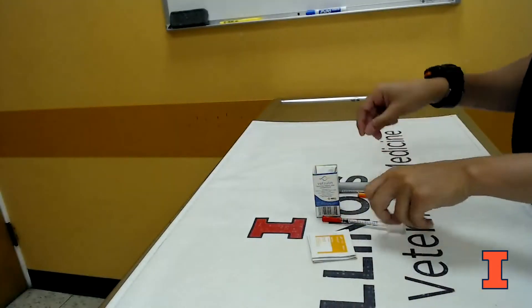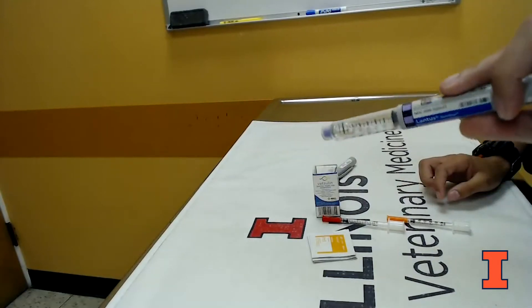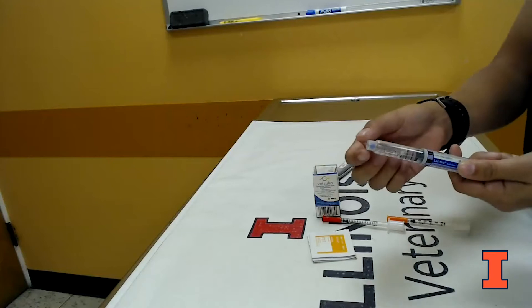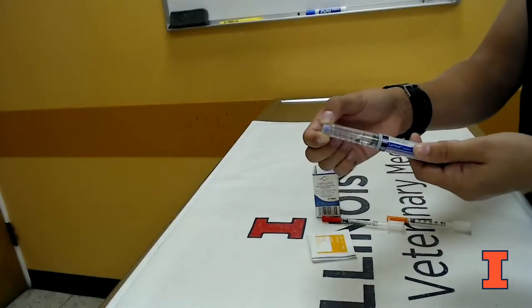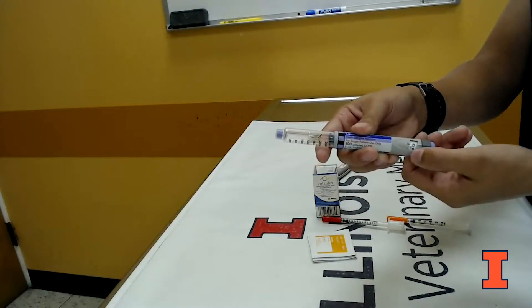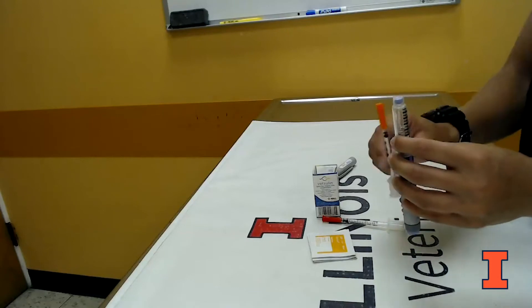We'll go ahead and start with the U100 pen. These pens are nice and clear — they're a solution, so they don't need to be shaken. You want to make sure it always looks clear if it starts clear. These can come with a pen needle that connects to the actual pen and is dosed by twisting the edge of the pen to the correct units. You can also use this like a vial and draw up your insulin with a syringe.